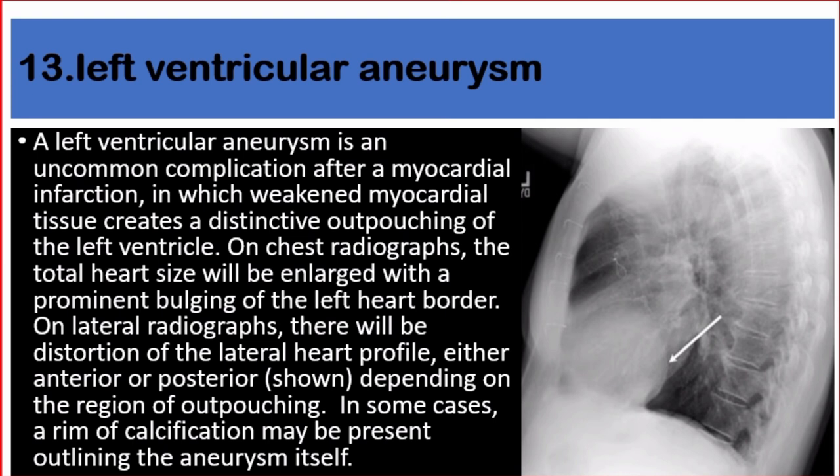Number thirteen: left ventricular aneurysm. Left ventricular aneurysm is an uncommon complication after a myocardial infarction, in which weakened myocardial tissue creates a distinctive outpouching of the left ventricle. On chest radiographs, the total heart size will be enlarged with prominent bulging of the left heart border. On lateral radiographs, there will be distortion of the lateral heart profile — either anterior or posterior — depending on the region of outpouching. In some cases, a rim of calcification may be present outlining the aneurysm itself.